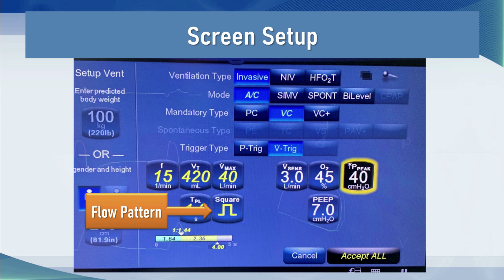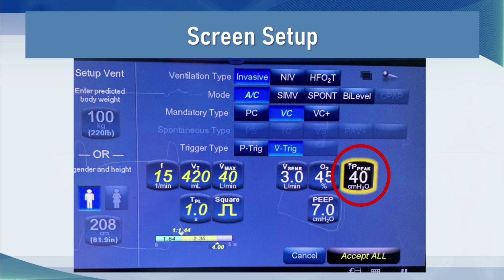Now this can be problematic. I'll get back to this a little bit later on, but you must set it, and it has to be a realistic pop-off level. Don't do something convenient for yourself like setting this at 50 or 60 or 70 centimeters of water. Here it's been set at 40. That's quite generous, but it's because this patient is presumably a little bit hypoxemic. A lower level of 30 might be more appropriate for the majority of patients, but just be very careful. This is a very, very important thing to set on a patient who is on volume controlled ventilation.